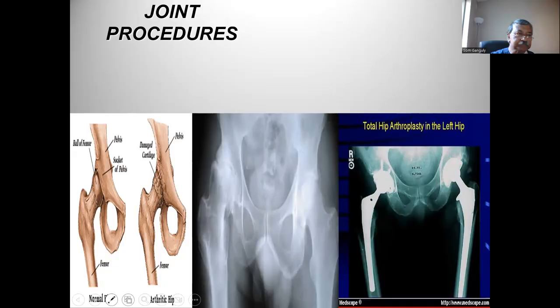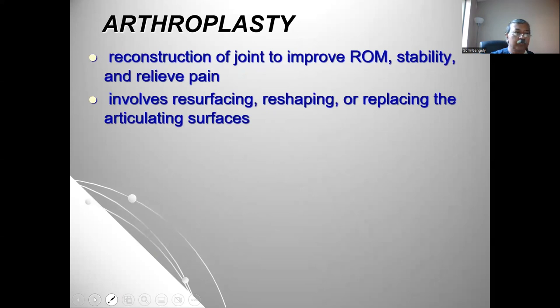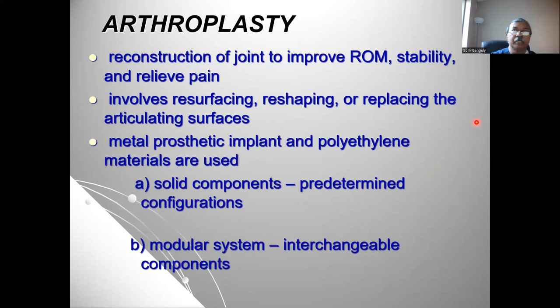So total joint replacement surgery, arthroplasty, is done to improve range of motion, stabilization, and mostly to relieve pain. It involves resurfacing, reshaping, and replacing the articulating surface. So where the structure articulates and creates the joint, by reconstructing those surfaces, we put in a new metal prosthetic implant or polyethylene implant, and we get a new reconstructed joint.